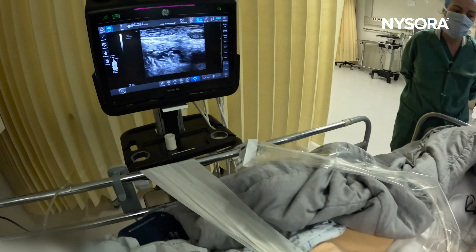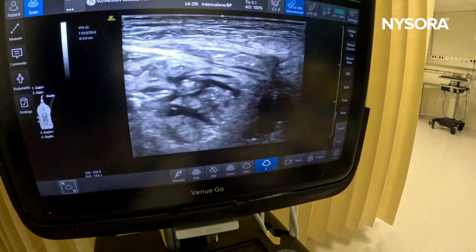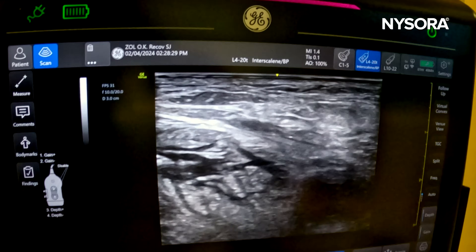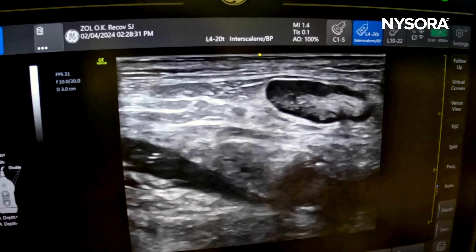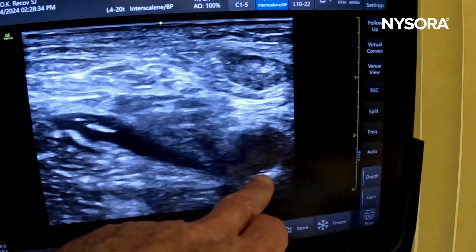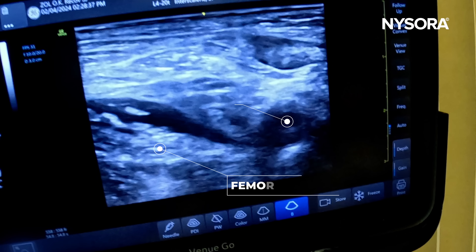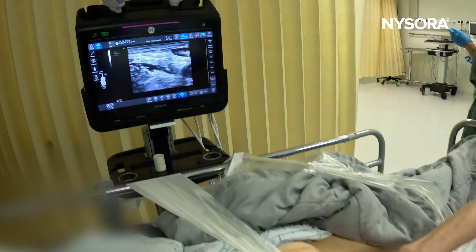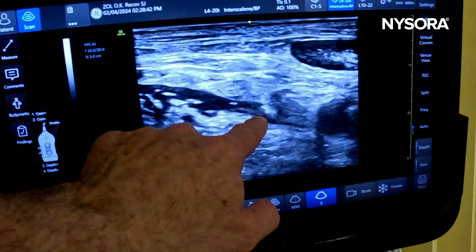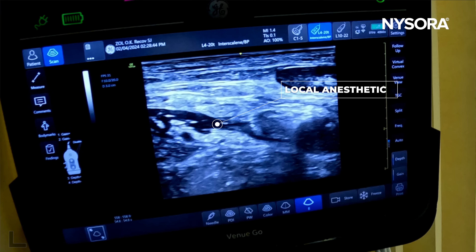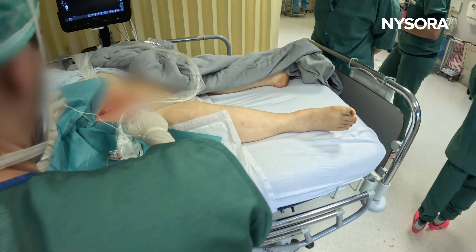We can see the femoral artery and the femoral nerve right there. There we go.